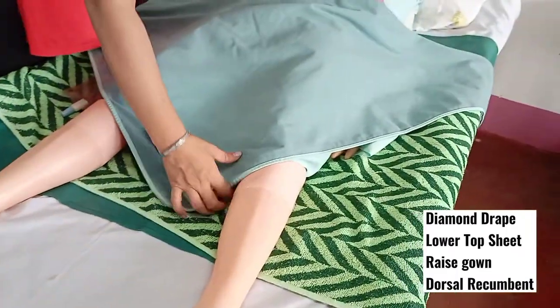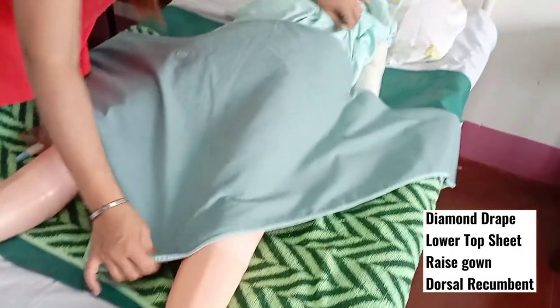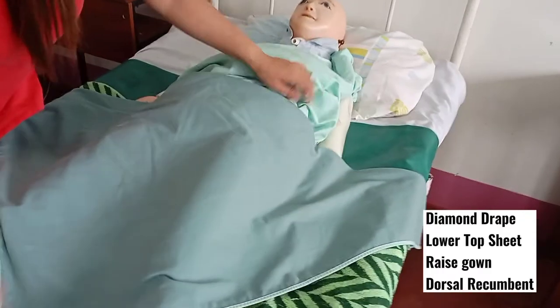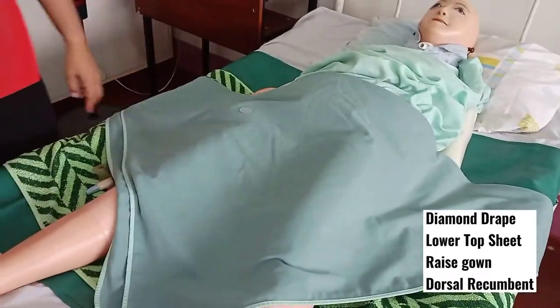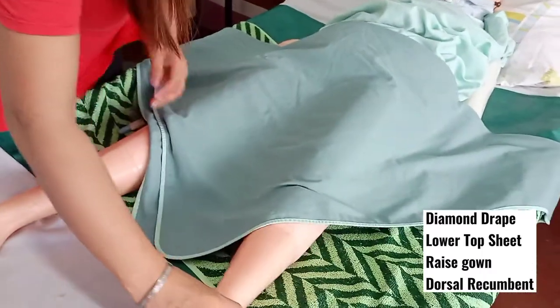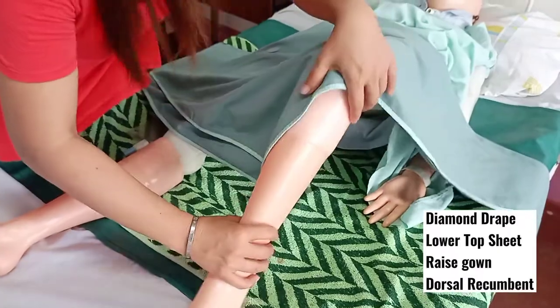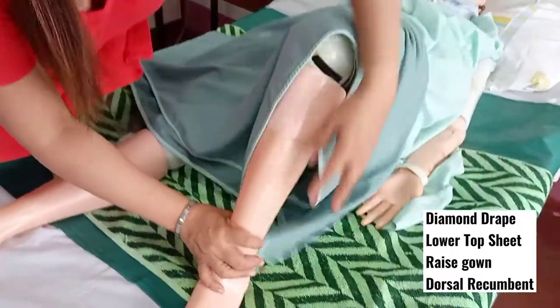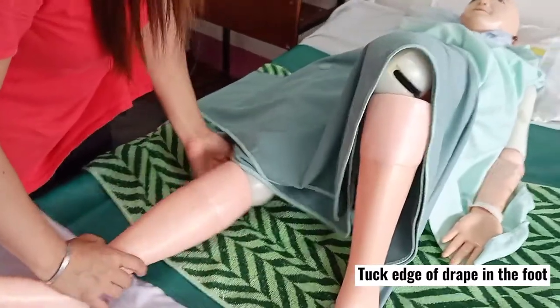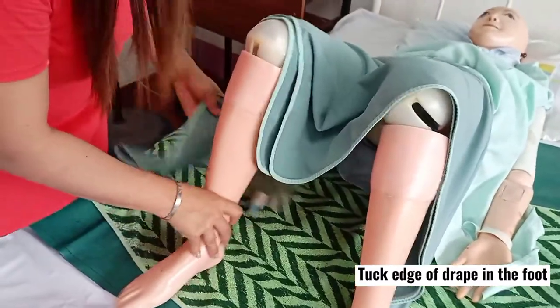Raise the gown, then place the patient into a dorsal recumbent position — far side, then near side, back to the edge.